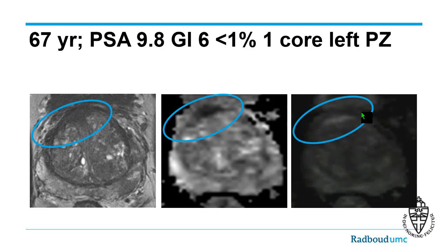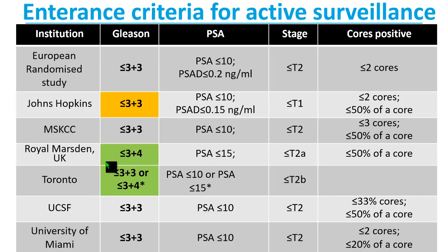So imaging helps you to find those patients who are opting for active surveillance, and it turns out that the patient cannot go for active surveillance because the patient has a Gleason 7 or higher. And this is also one of the reasons: if you stick in a needle, then most likely you will sample this part up to the 1.7 centimeter line. And beyond that, you really have to perform a targeted biopsy to find those lesions.